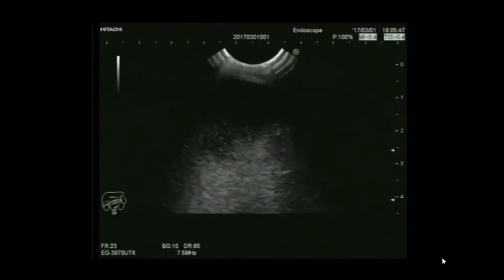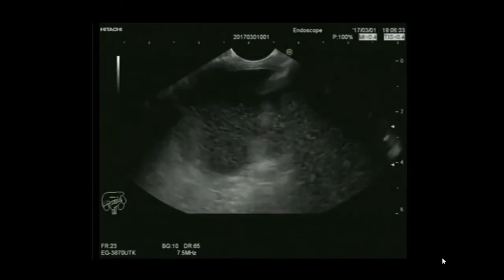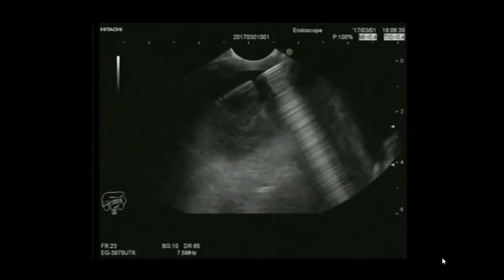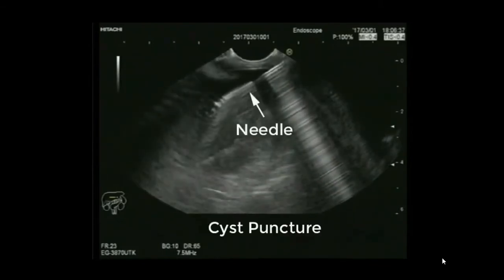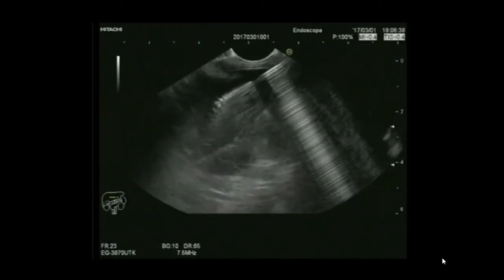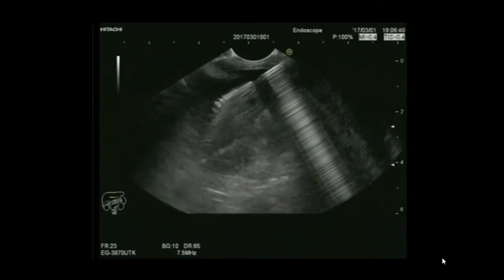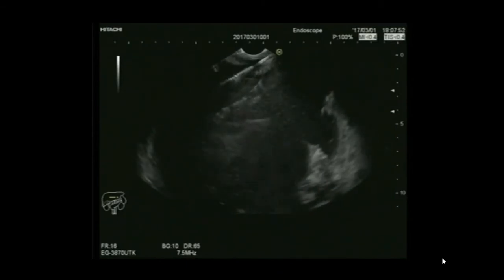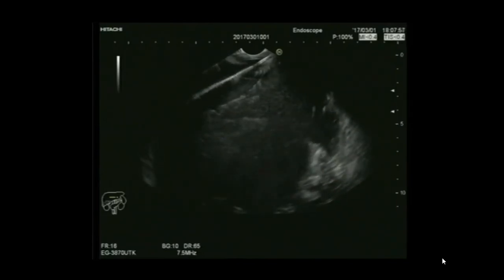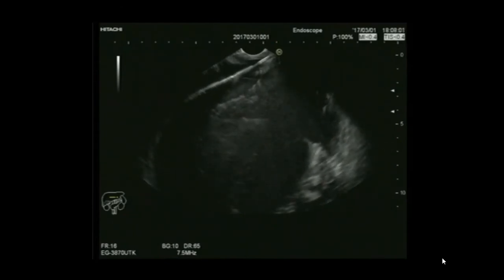We use Doppler scanning to find an area where no vessels intervene between the puncture site and the cyst. Once the point is chosen, the 19-gauge needle punctures the cyst. We can see the needle inside the cyst — the 19-gauge needle accepts a guidewire, which is then passed and coiled inside the cyst.